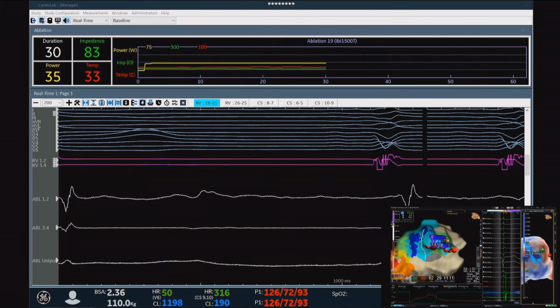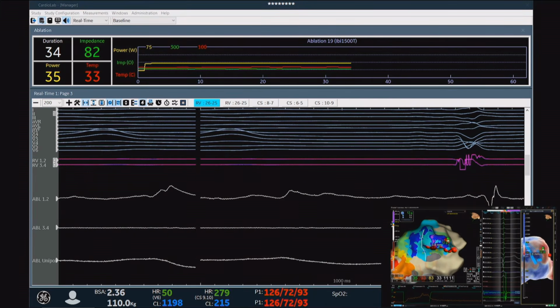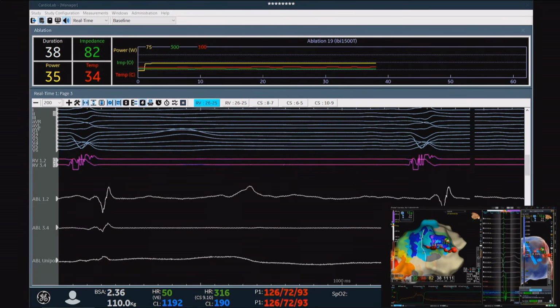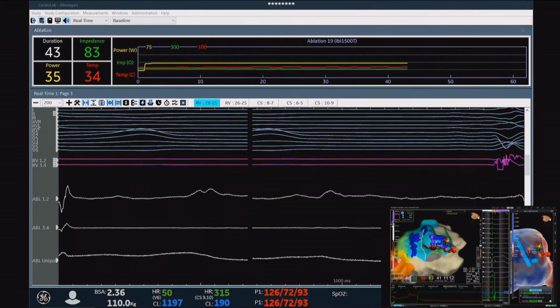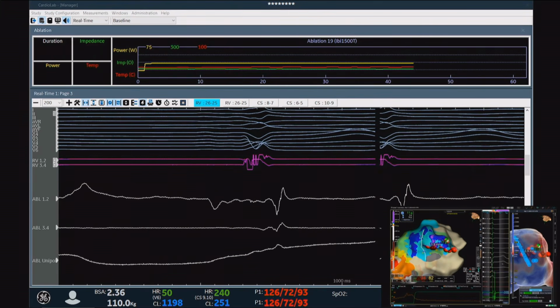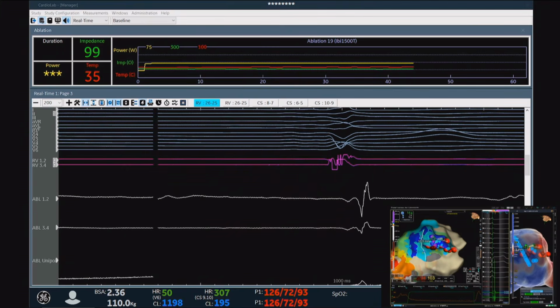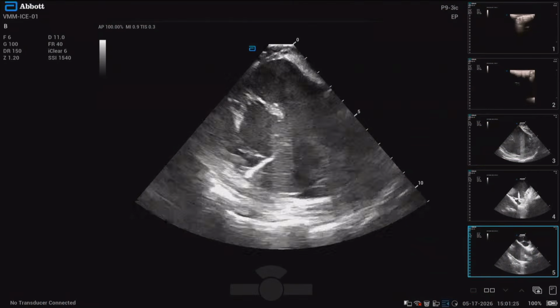Yeah, but remember, with the wall thickness you also have to put into the equation the fat and the fact that it's scar. So RF, even in animal models, in a chronic scar like this one, you honestly cannot. If you can switch to ICE, just to show another way, so you combine everything. Can you switch to ICE for a big screen for the audience?